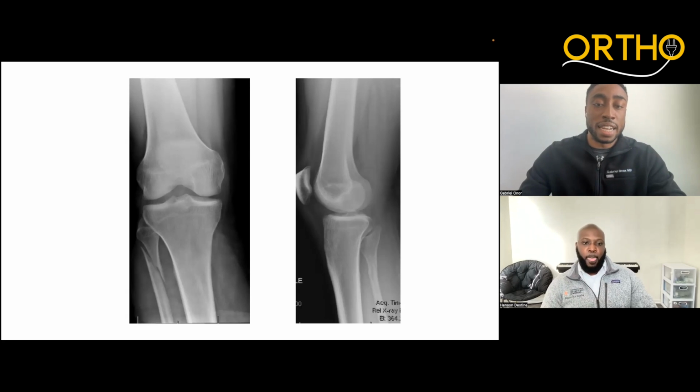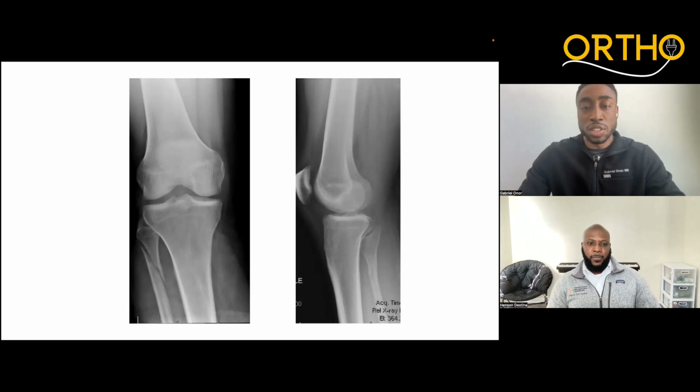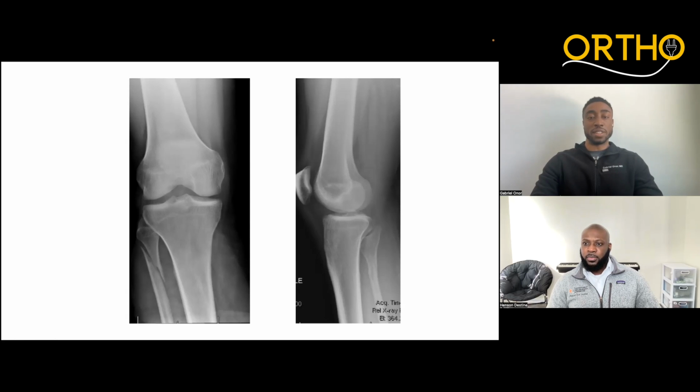In addition to that, obviously on the x-ray, you're not really going to be able to definitively tell whether something's opened versus closed. So I would always just ask on the phone as well, hey, is this thing open, closed? And that puts your mind towards what's the urgency of this. Additionally, because this is a shaft fracture, you're not necessarily worried about whether something is dislocated or not.